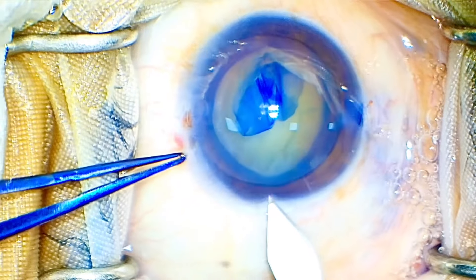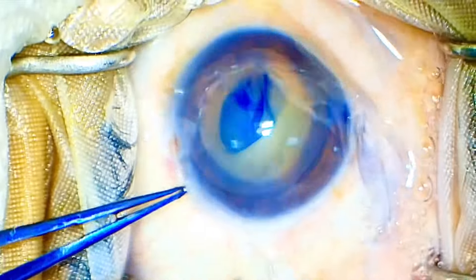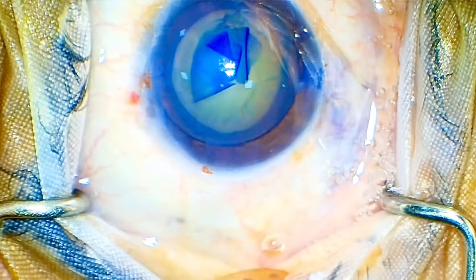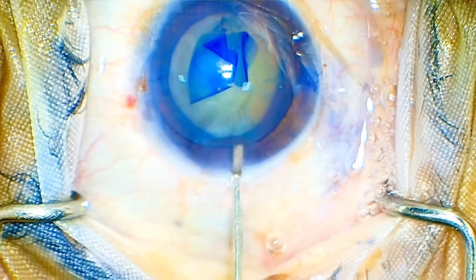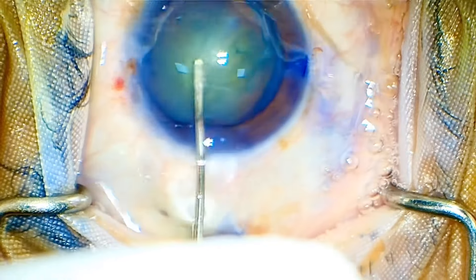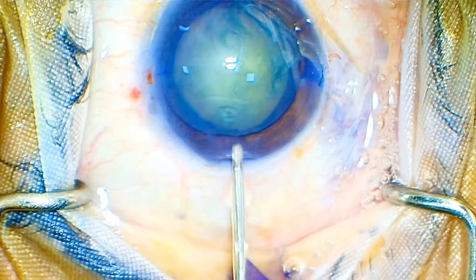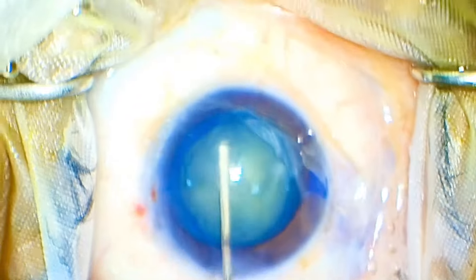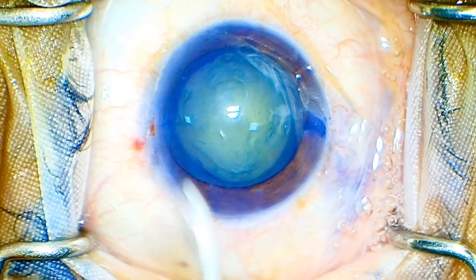I have made a triplanar incision — as you can see, the first plane, the second plane, and the third plane parallel to the iris. I have entered the AC. The patient looks very cooperative and calm. We are going to have a good hydrodissection just like that. This case is an unedited video — I have not edited it, though I have sped up some patches to keep you engaged throughout.